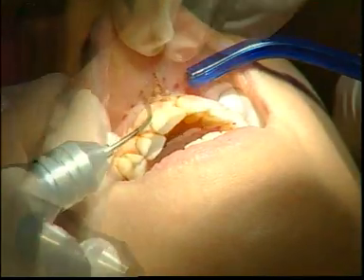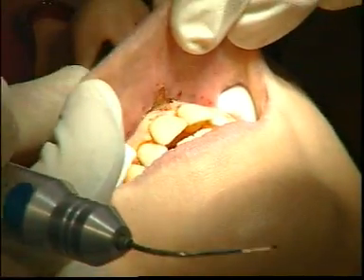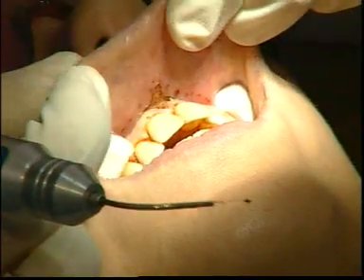The use of sutures has been omitted deliberately. Functional wound healing takes place in the healing phase.